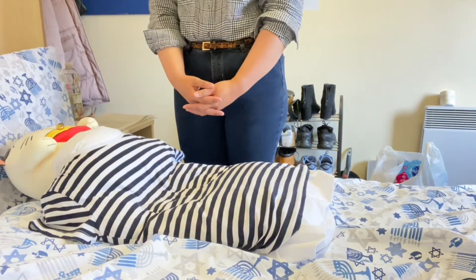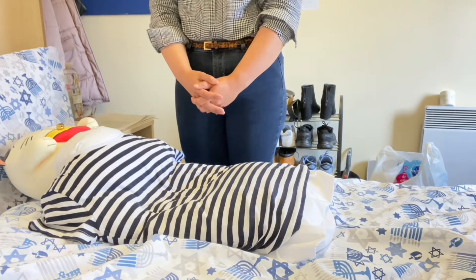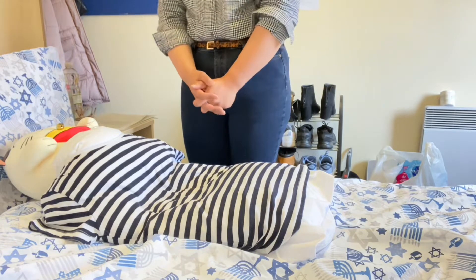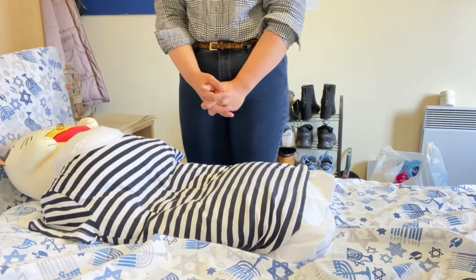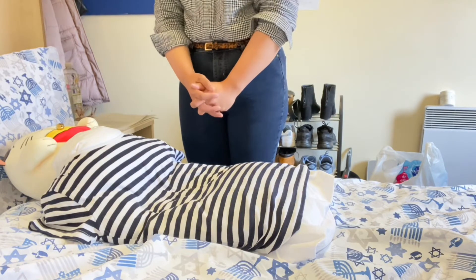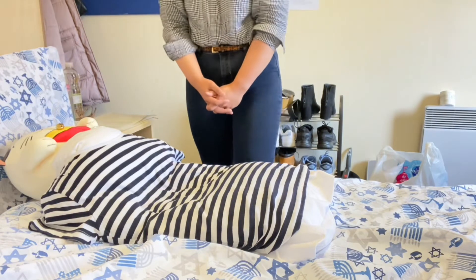My delivery team arrives. I will hand over the patient. Situation: patient found collapsed. Background: 69-year-old, 3 days post-op. Assessment: patient has no signs of life, no response. 3 rounds of chest compression of 30 to 2. Recommendation: move to ALS algorithm.